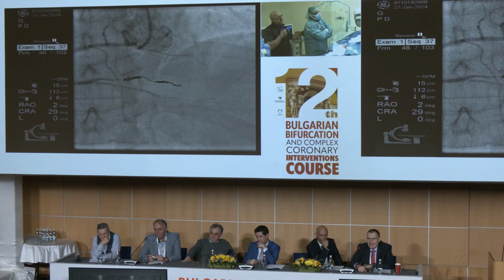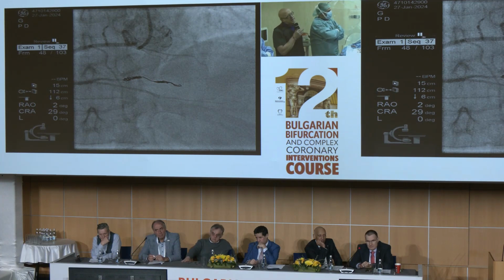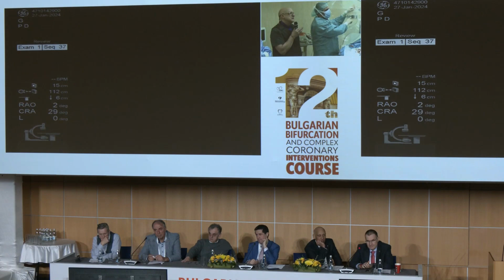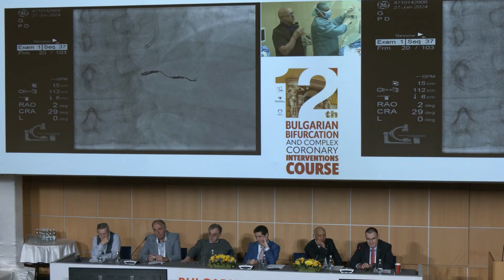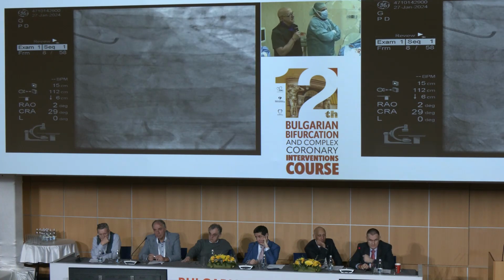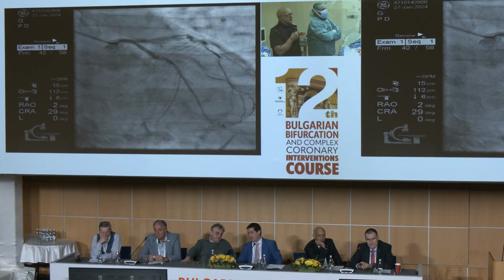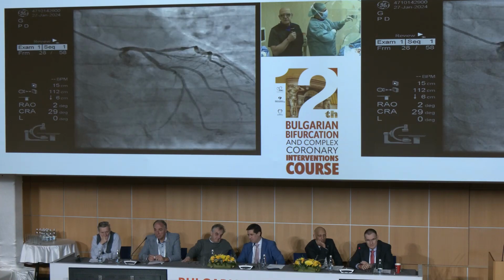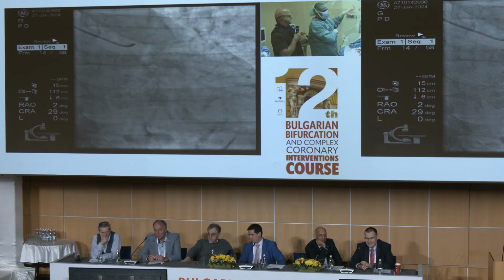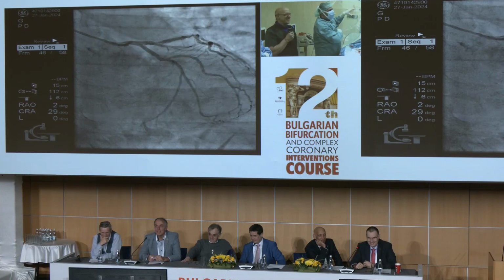No, but we decided with Gianluca that probably it is better to postpone the procedure because of the contrast issues and the renal insufficiency. And the second thing is, when we go on the left main, if quite rarely something happens with a pericardial effusion, that will put the patient in trouble, in an easy position. So we are going to deal with this left coronary on Monday, and Gianluca can stay with us, just to finish the case.